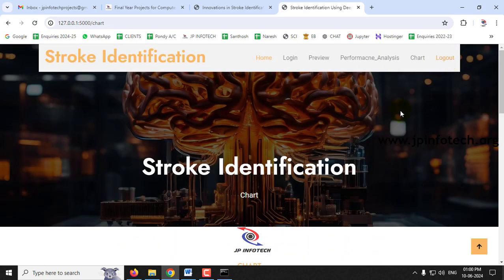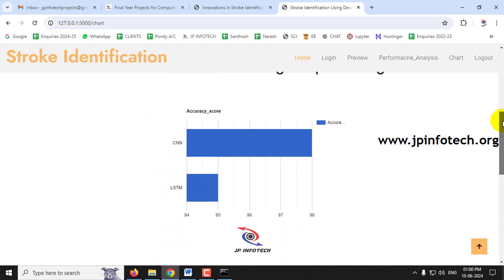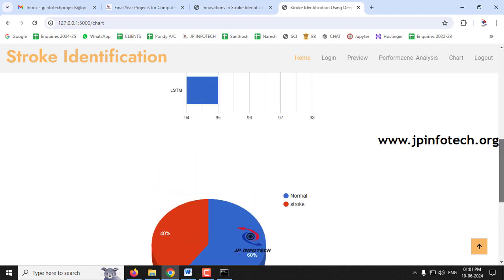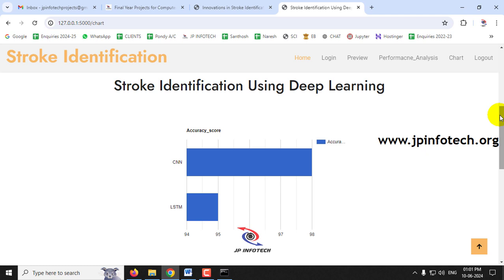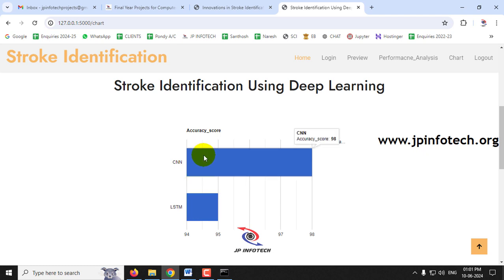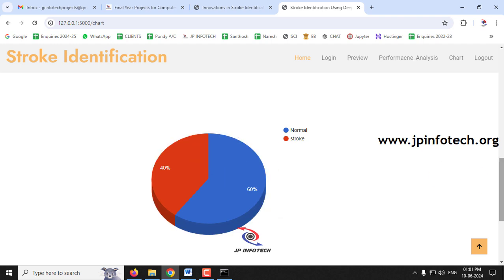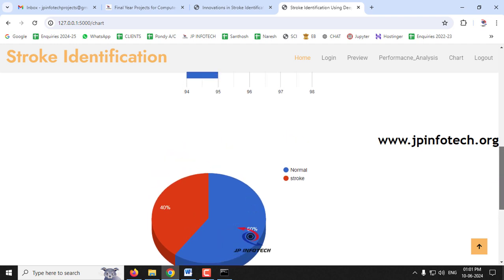Finally, clicking the chart menu navigates to the chart section. Note that both charts are static since no database is used. The first chart shows the accuracy score of CNN at 98% and LSTM at 95%. The second chart depicts the dataset distribution: 60% normal images and 40% stroke images. These charts do not vary based on input values.